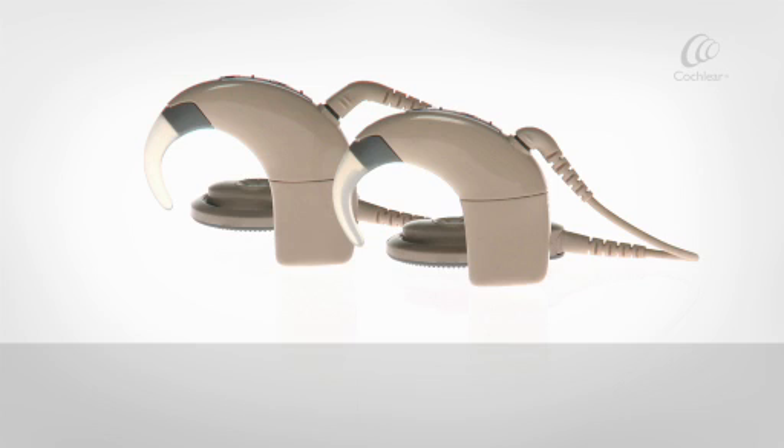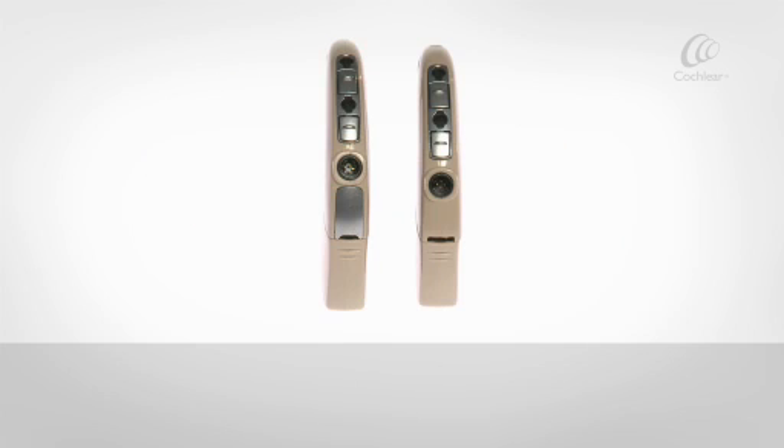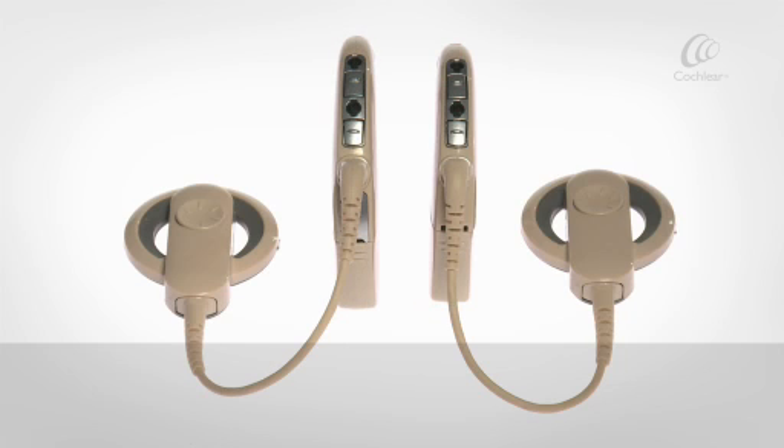You can choose either the CP910 or CP920 processing unit. The CP920 processing unit has no accessory socket and is smaller than the CP910 processing unit. Both sound processors operate in the same way, except the CP910 sound processor can work with the Cochlear Nucleus range of accessories.